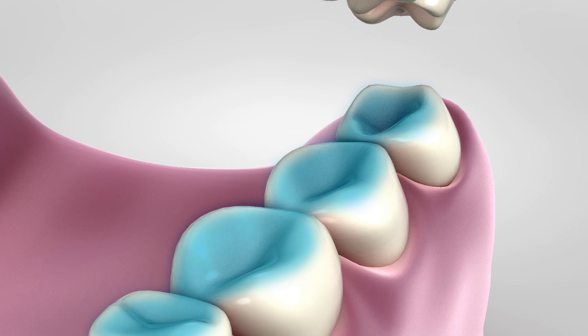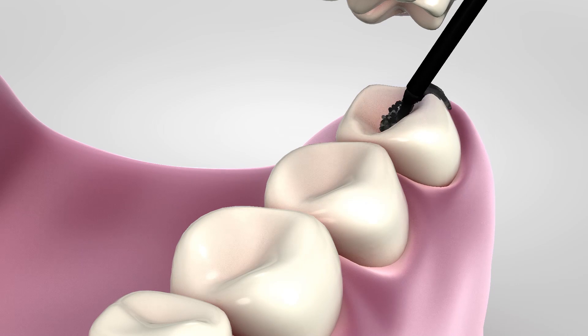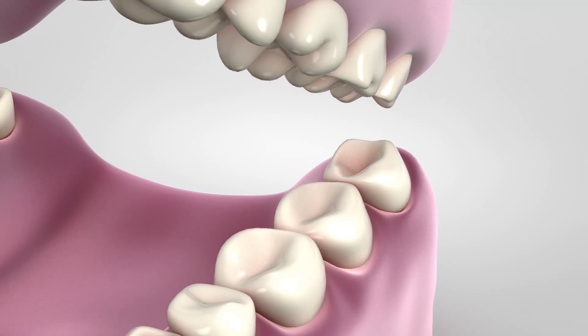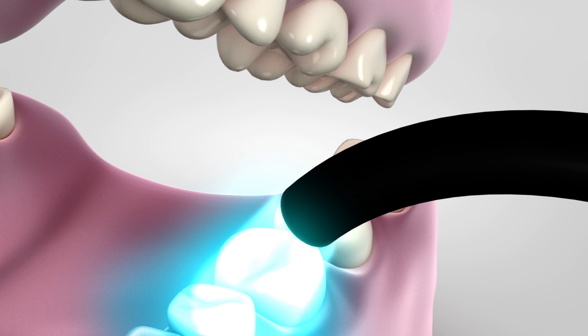Once the gel has been rinsed off and the tooth has been dried, your dentist will place a liquid plastic material in the grooves of your tooth. A special blue light will harden the plastic, and the plastic forms a sealant.